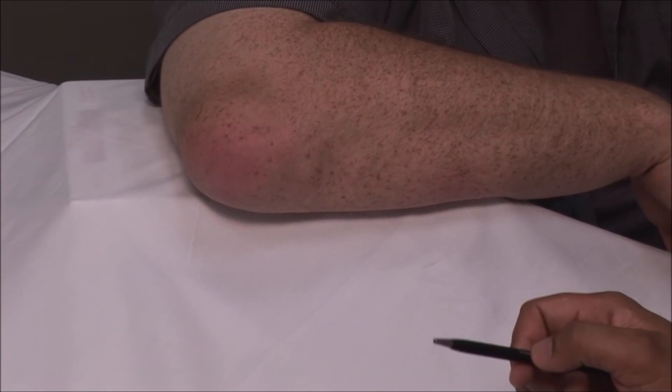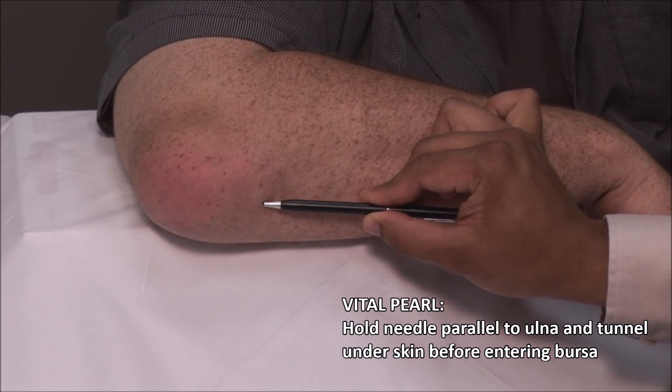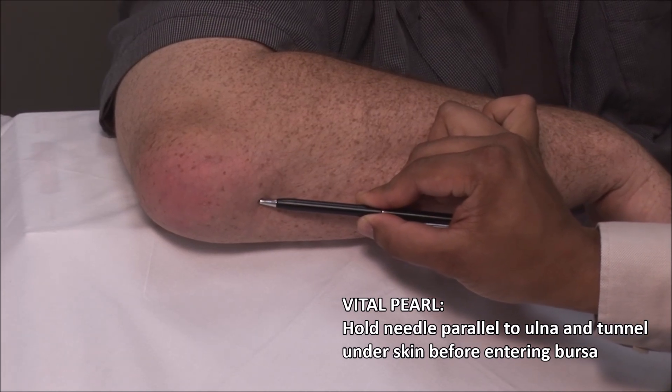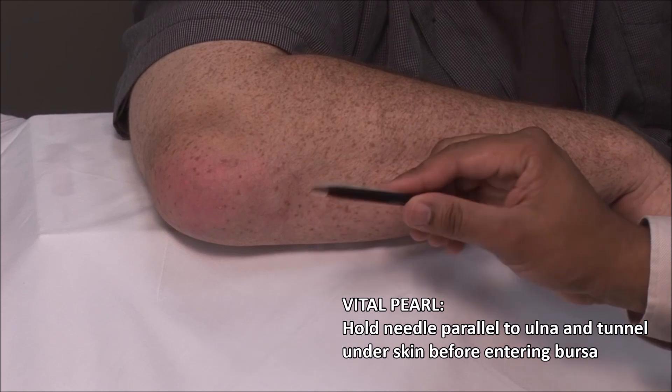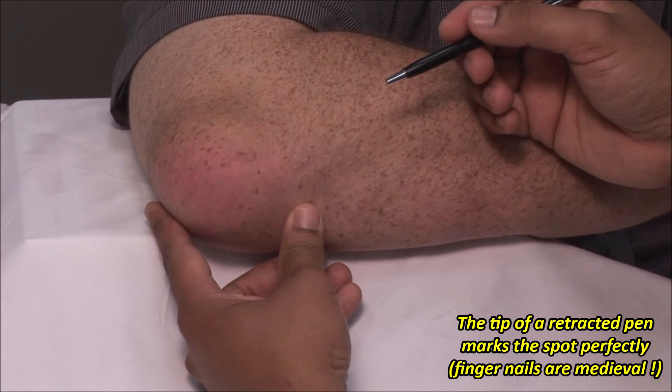Instead, the needle should be directed parallel to the ulna and tunneled under the skin before entering the bursa. Using a retractable pen, mark the skin about 1 cm distal to the bursa.